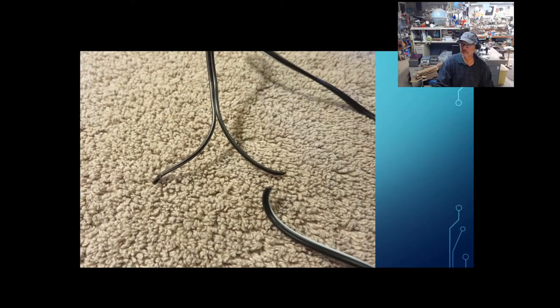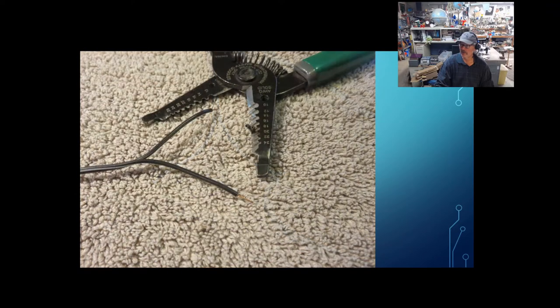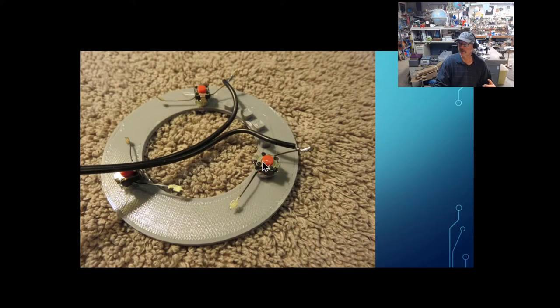Cut them in half. Once it's cut in half, you're going to strip off just a quarter inch or so of the wire. No magic number there. And once you get it stripped off, then you're going to take one wire of each side and solder it to one half of each switch. It makes no difference which wire goes where. Either one's perfectly fine. It's just one wire on one side and one wire on the other.